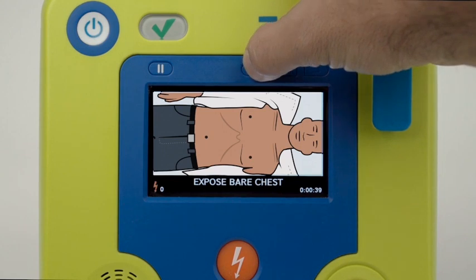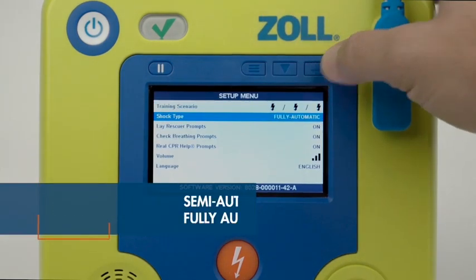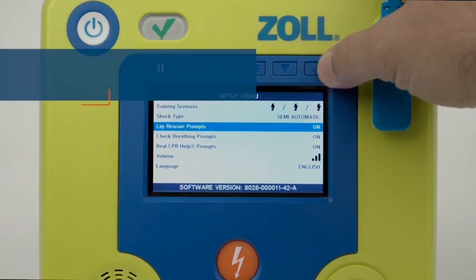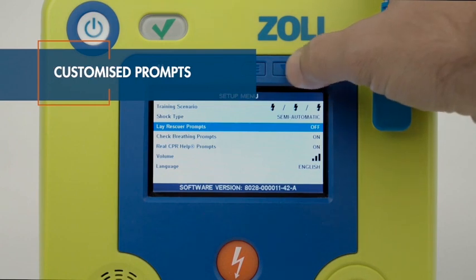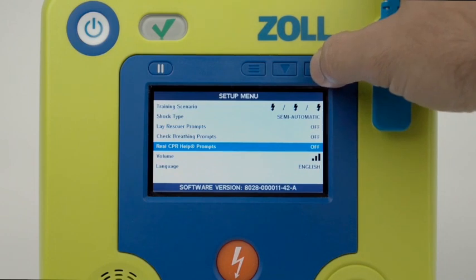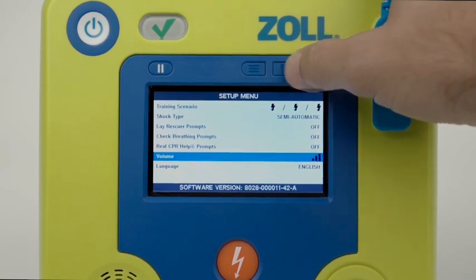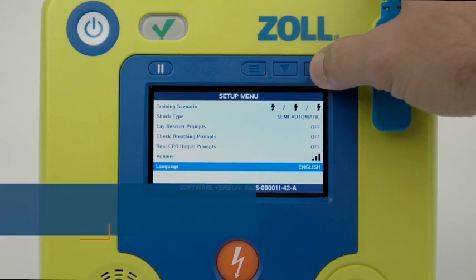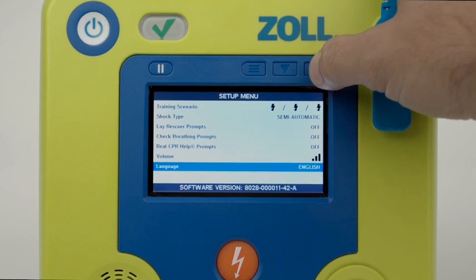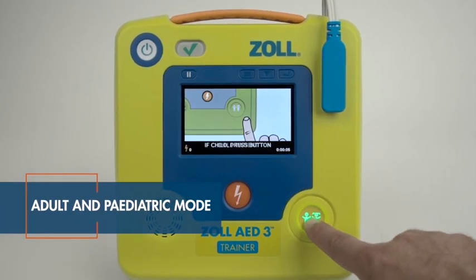All options are configurable on the trainer itself. One trainer can be used for both semi and automatic modes. Prompts can be customized to match protocols and clinical device configurations. Volume is adjustable to suit any training environment. Flexible language options offering up to three languages per device. Adult and pediatric mode is also configurable.